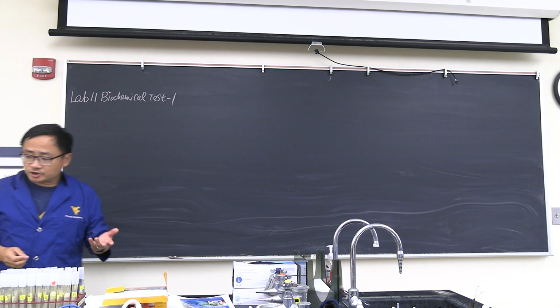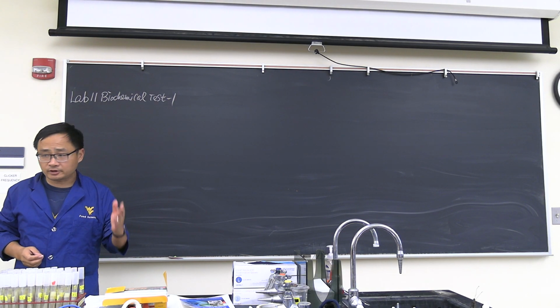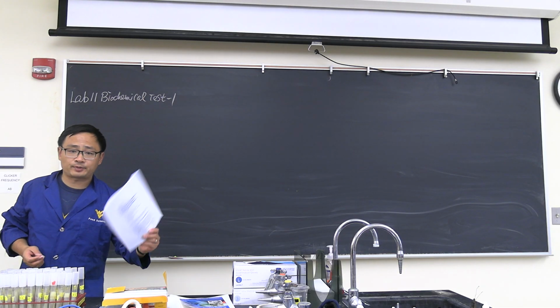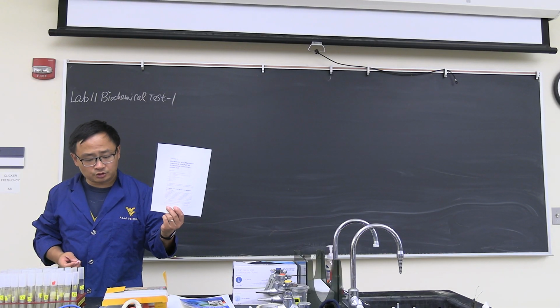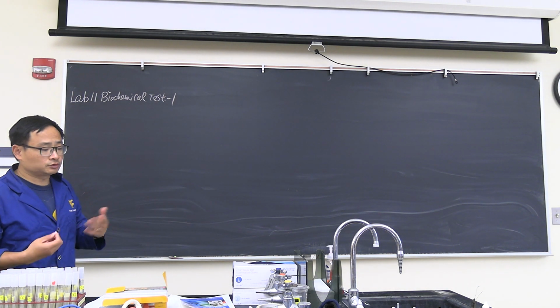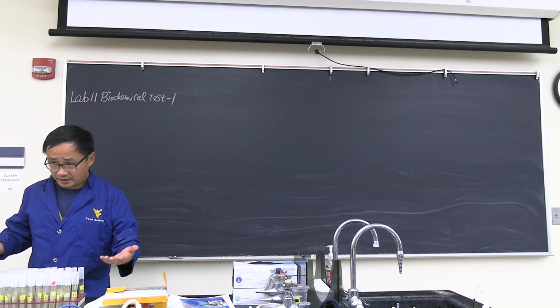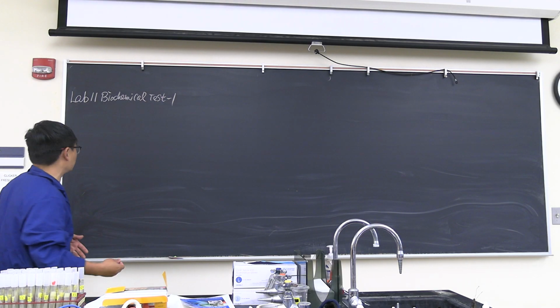So our lecture after next week, we will move to exam 3, will be biochemistry and genetics. And our lab at the same time, corresponding to that, will do the biochemistry test for bacteria. And we will introduce you around 7 to 10 tests. Okay, so we'll do these one by one. Among them, we will be inserted the clinical microbiology lab, and today we'll do one. So I'll explain to you later why we wanted to do that today.